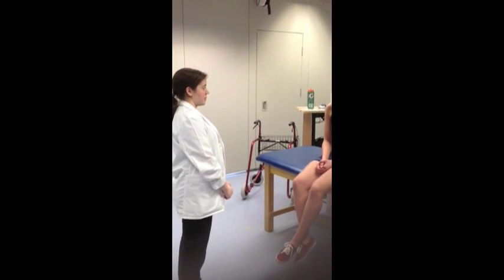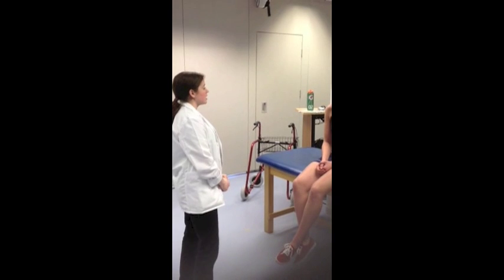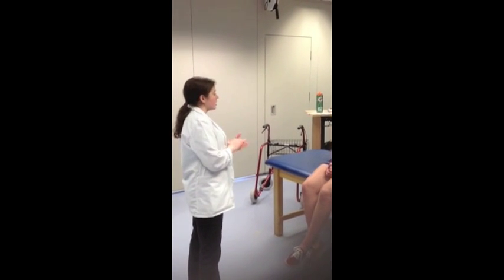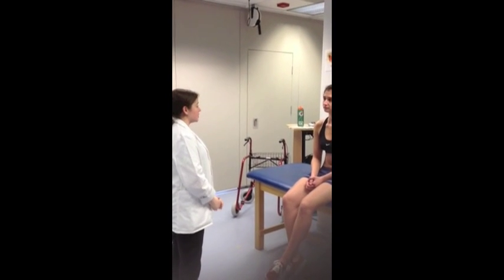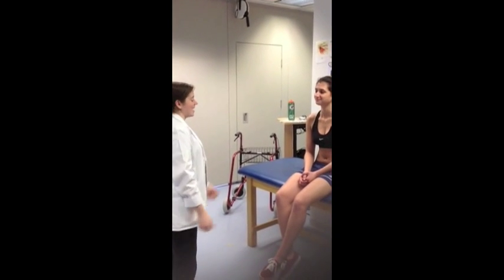So today we're going to have you do side bending of your trunk. We're going to measure that. The purpose of this test is to get an objective baseline measure, so we know where you're starting at and we can measure your progress from there as we go on with our physical therapy sessions. Sound good? Alright, so I'll have you stand up.